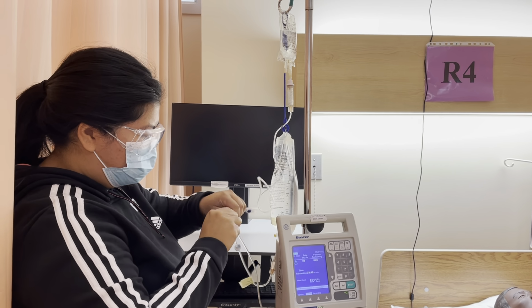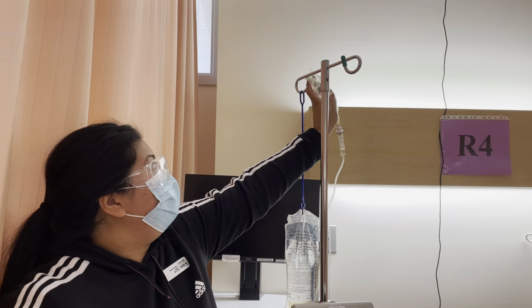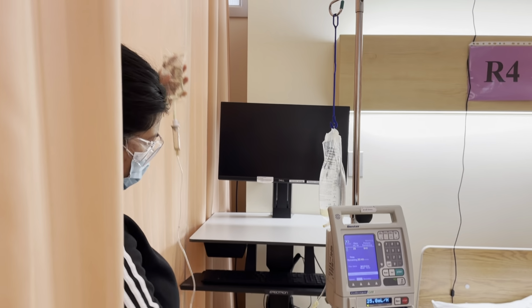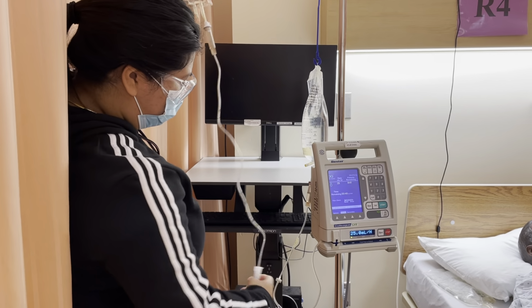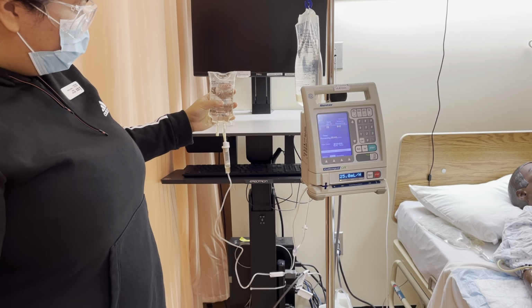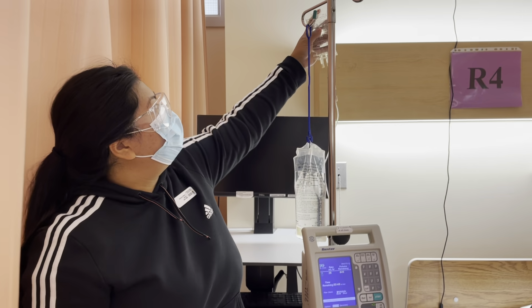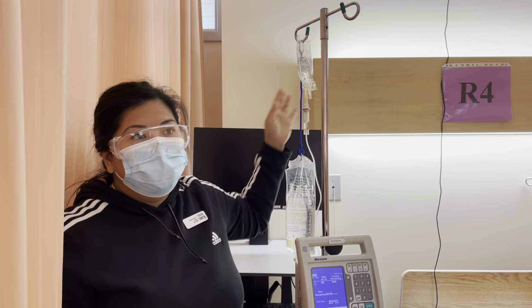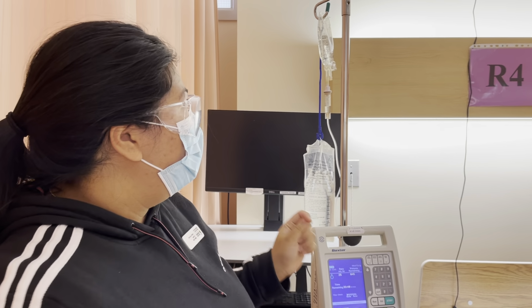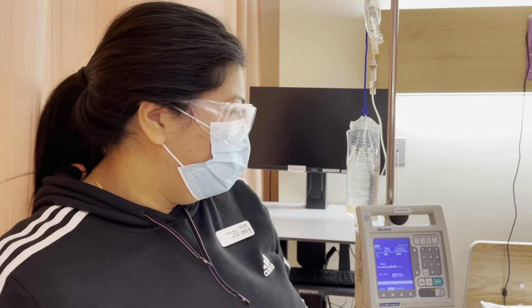We're now going to begin to set up for our secondary. And then we'll prime our secondary tubing to get rid of the air from the tube. And then once it's about a third to a half full, we'll put it up higher again. So we want to back prime to make sure that we maintain a closed system and to prevent medication loss.